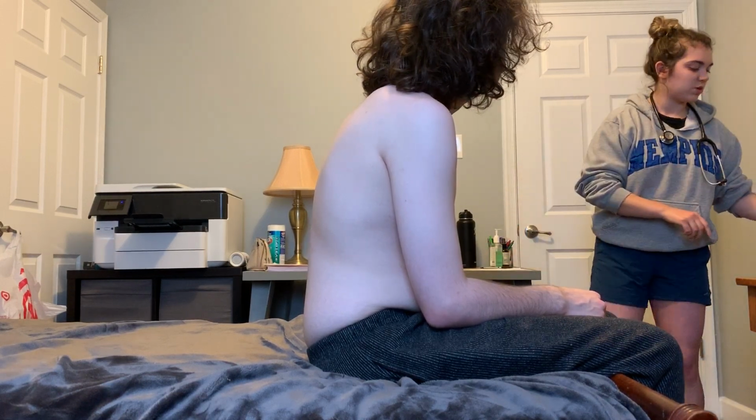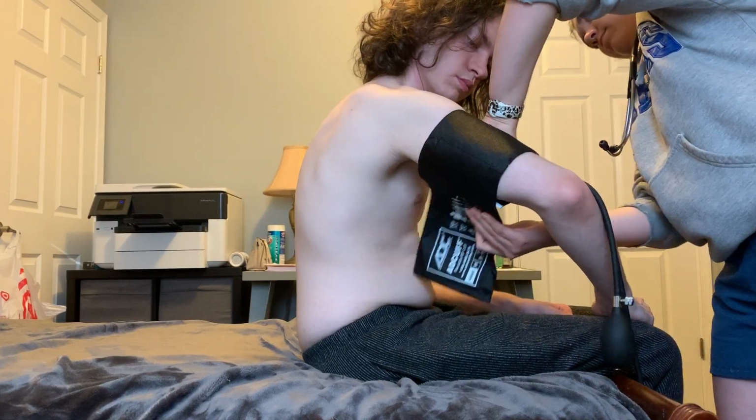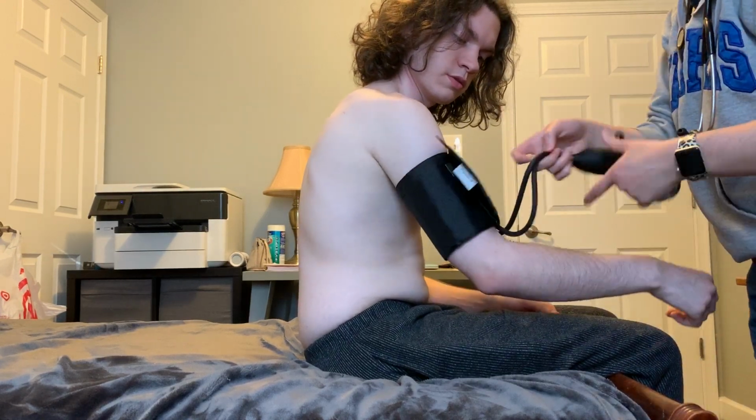And so next I'm just going to take your blood pressure. Is that good? Not too tight? Yep. And you relax your arm.